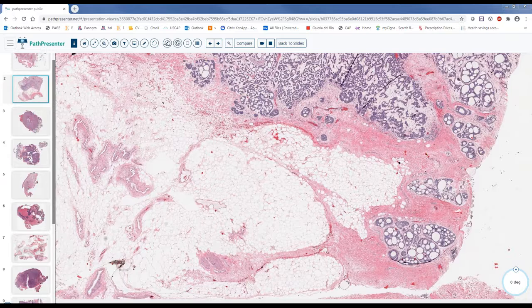Maybe even lung sometimes, although this tumor is TTF1 negative. So it's not an easy task. But also, if there is a breast mass, it is likely to be primary from the breast. Usually we don't have this problem in daily practice. Theoretically, yeah, it can happen, since salivary gland tumors can go everywhere.